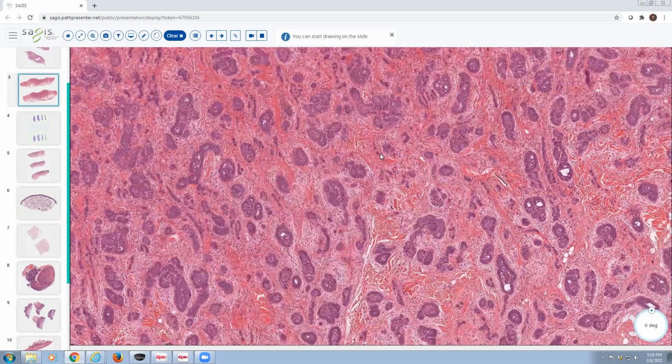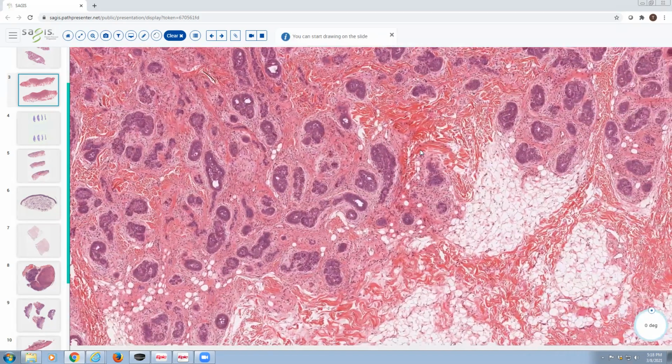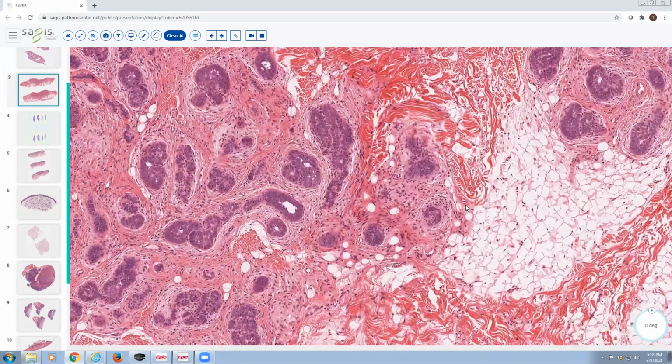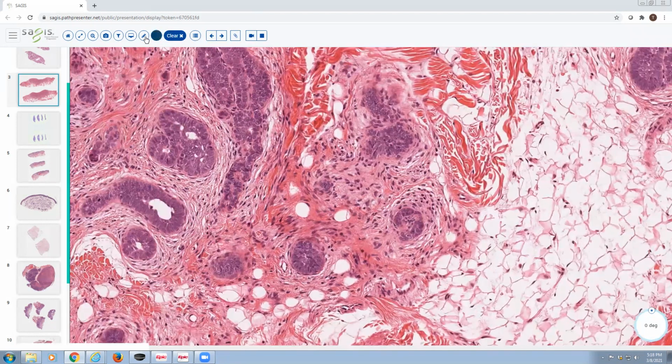And then the hallmark finding that you really want to hunt for and find in trichoepithelioma and trichoblastoma is called a papillary mesenchymal body. And here's a good example of a papillary mesenchymal body. A papillary mesenchymal body is a primitive hair follicle. So it loosely resembles the base of a follicle where a hair bulb is in development. So this is a primitive hair germ or primitive hair structure. It's called a papillary mesenchymal body.